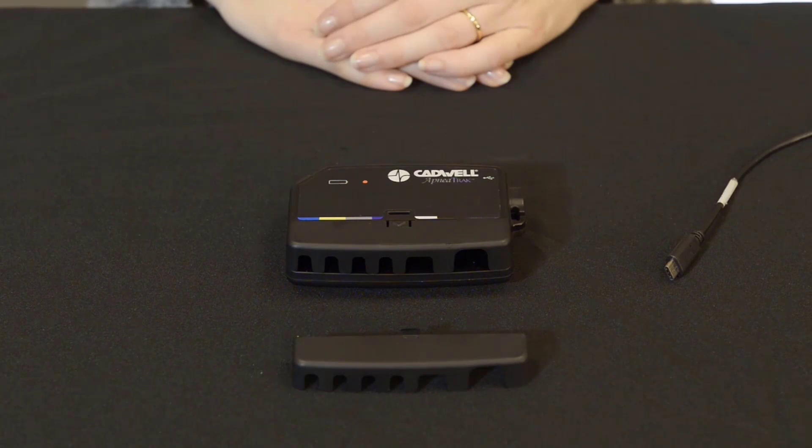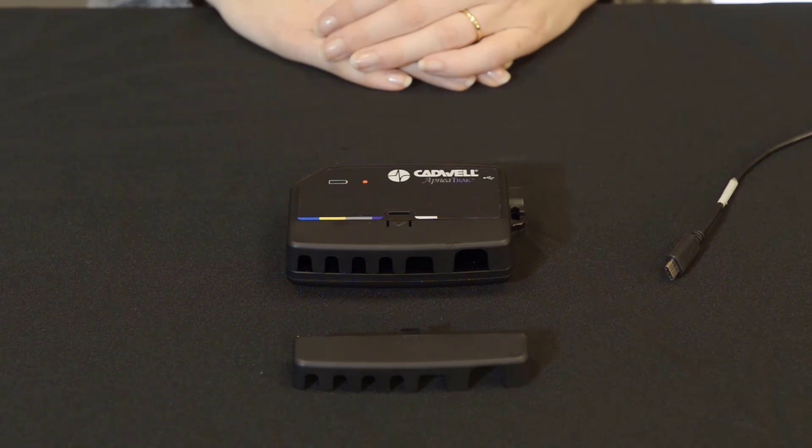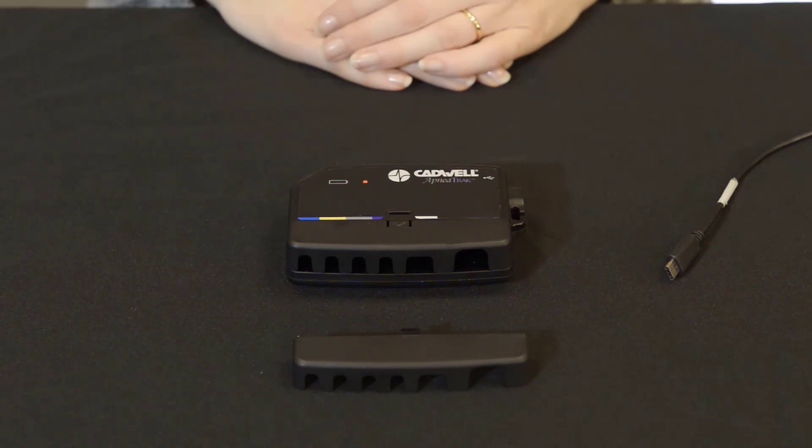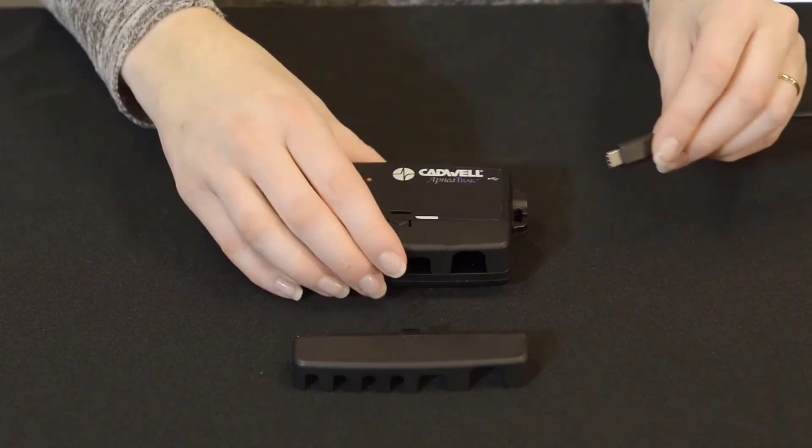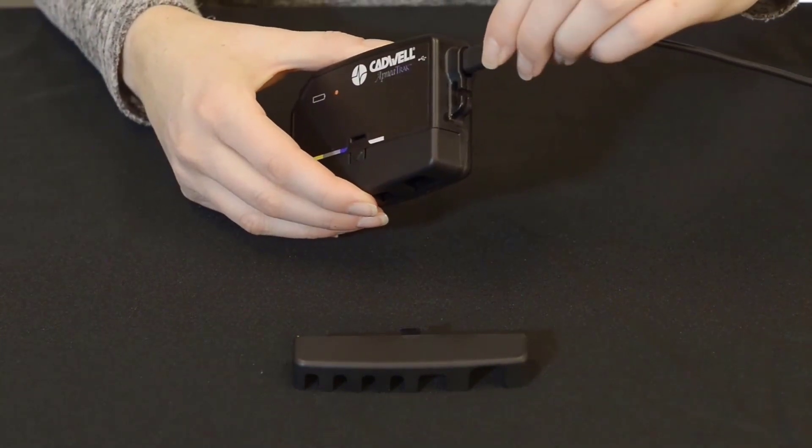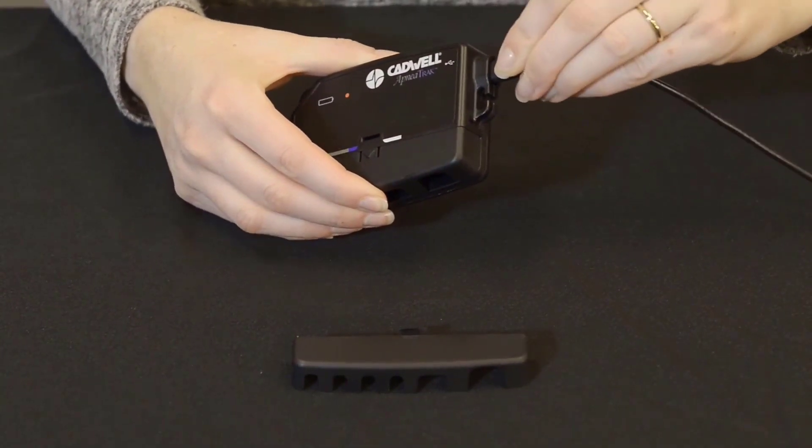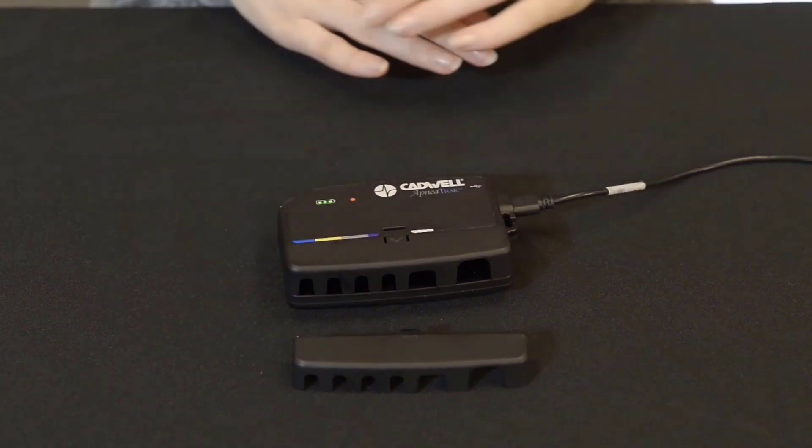Typical charge time from 0% battery is about 4.5 hours, but 5 hours for first time will allow the device to better gauge the battery life. A typical charge time after a single night study is about 45 minutes. To charge your device, connect the device to the computer using the USB-C to USB-A cable provided with your ApneaTrak.